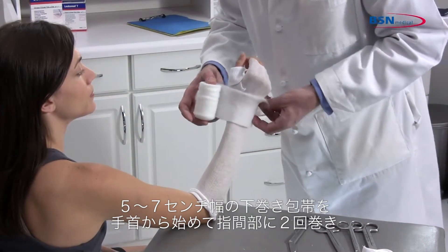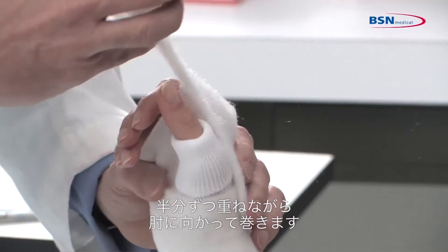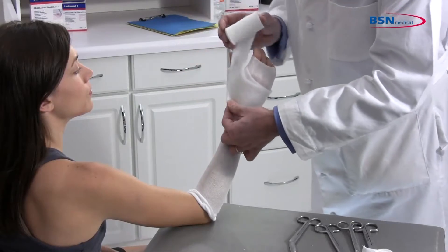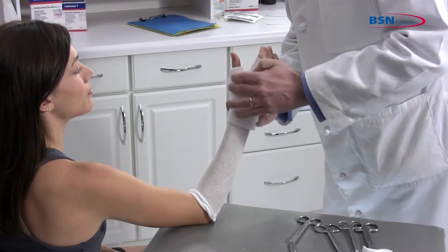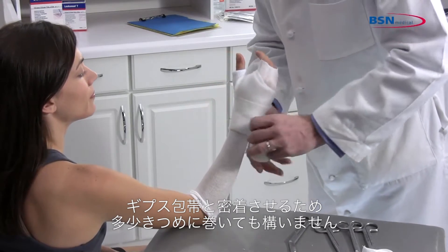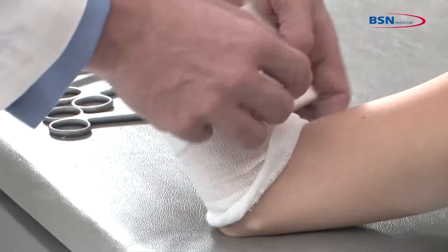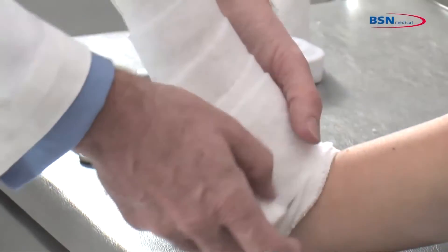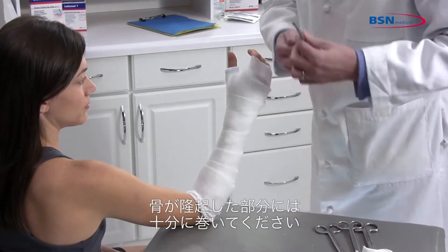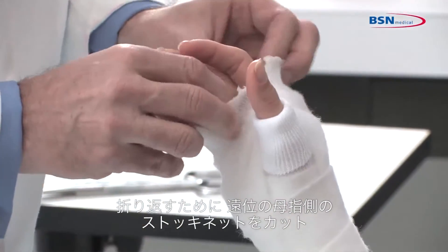Using 2-inch or 3-inch padding starting at the wrist, go through the web space twice and work toward the elbow, overlapping by 50%. Applying with a slight tension will allow the padding to lie down smoothly and have a snug fit. Additional padding may be required for bony prominences. Cut the stockinette distal to the thumb side for an easy fold back.